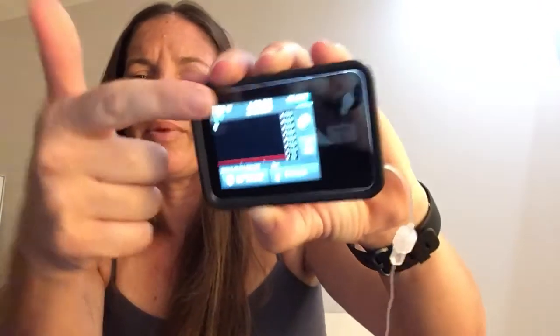Now I'm going to go to Start Sensor. I know my code — five, nine, three, seven — I'll hit Enter. Code confirmed. You are ready to start your CGM. New sensor readings will display. Start sensor — sensor started. There's my little screen letting me know that my sensor has been started, so this should be good.